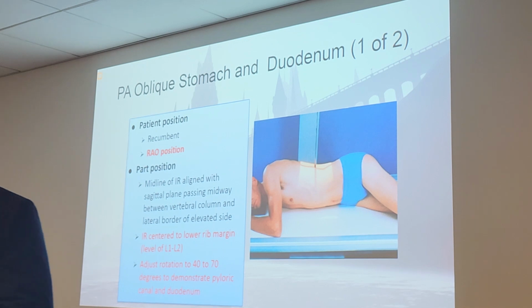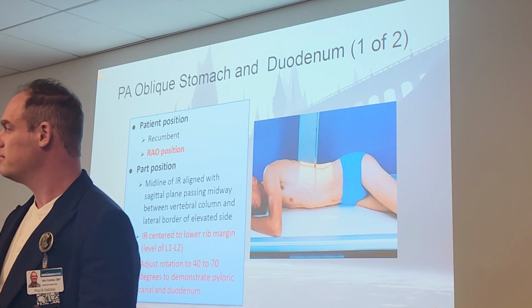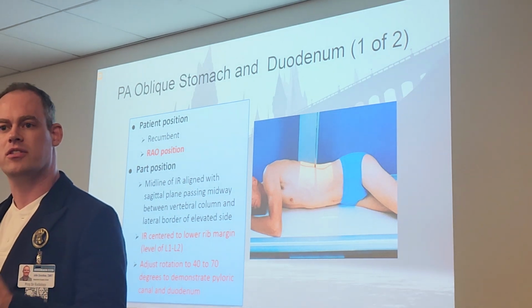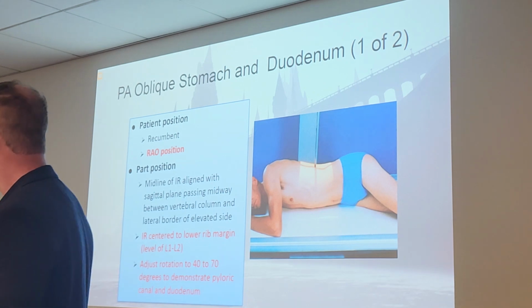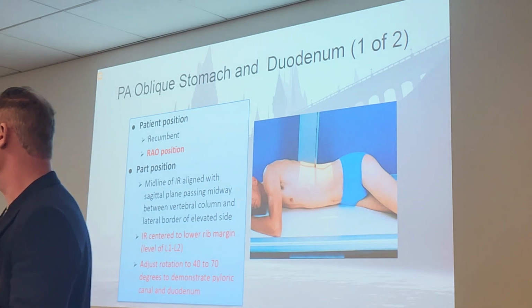Let me ask you this question before I show you the next slide. For an RAO, where's the barium going to be? There's your key word right there. It's still PA. So where's it going to be? Pyloric portion. Body and pylorus. So the air will be where? In the fundus. Correct. Don't let the word oblique throw you off. It's still a PA position. Therefore, that barium will still be in the same area as a regular PA.